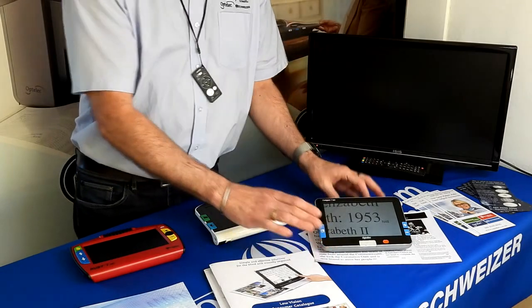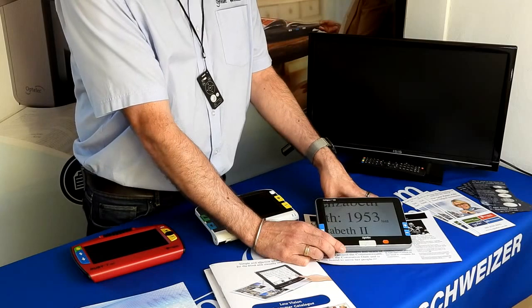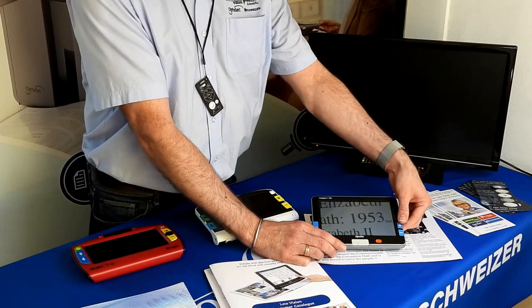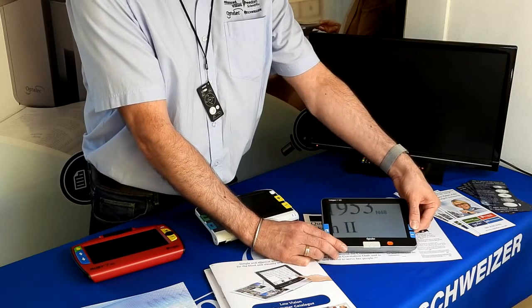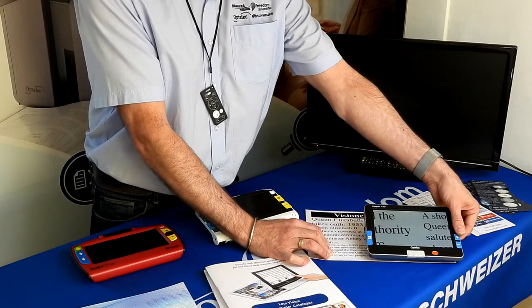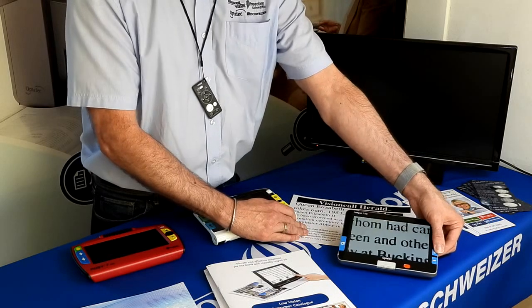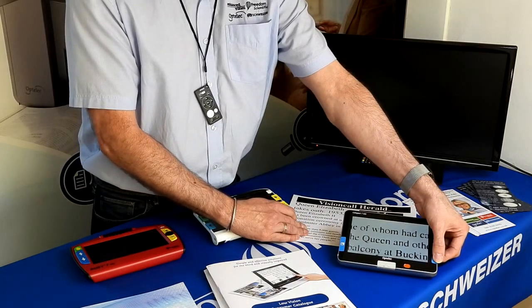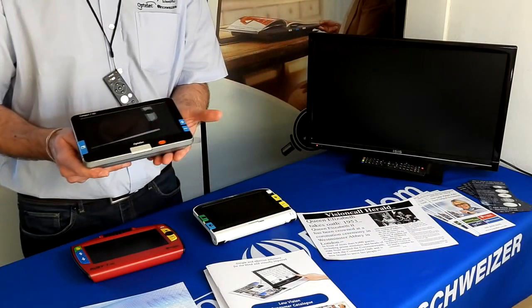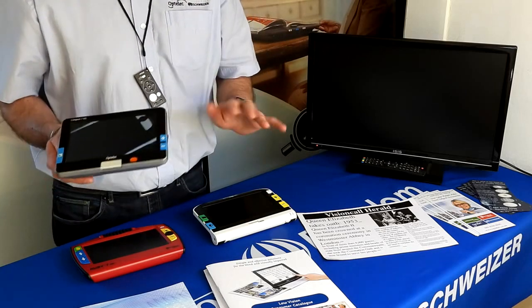When the machine is placed on top of your reading material at a preferred angle — so you're not having to lean over — you can move it left, right, up and down, and magnify all the way up to 24 times on this machine. Even the smallest text can be magnified quite large. The Compact 7 is our heaviest machine as it's all-metal construction, which some people like and some don't.